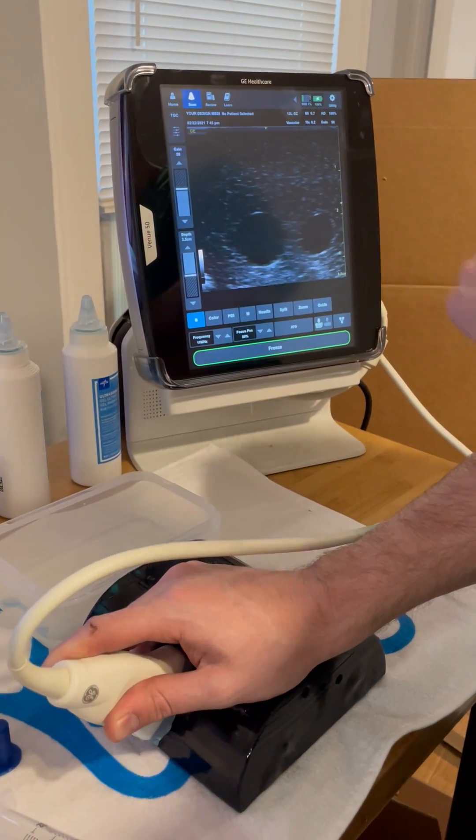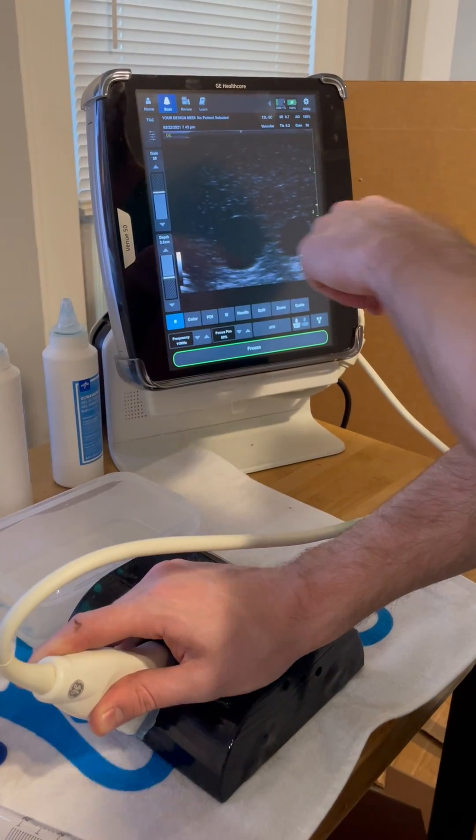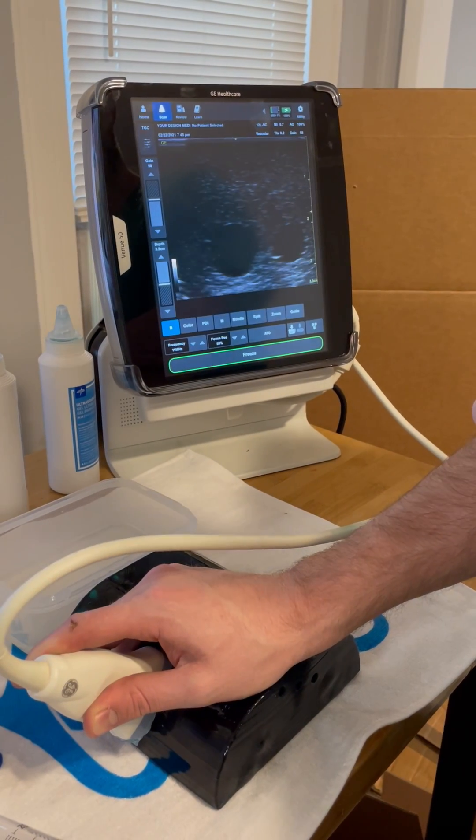On the Phantom, you'll find that there are two vessels that are closely paired together — one representing a vein, one representing an artery.